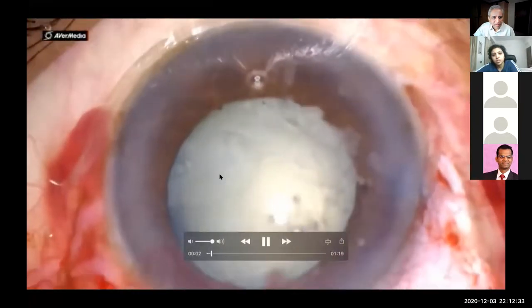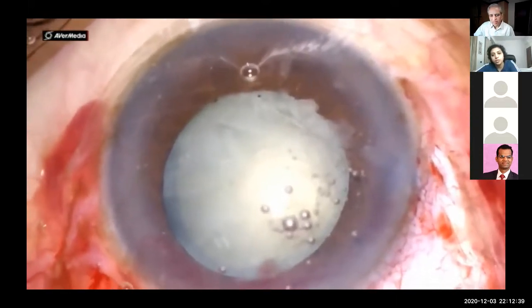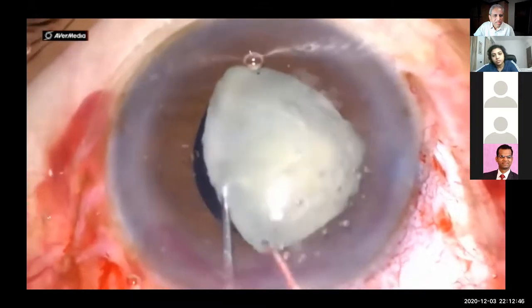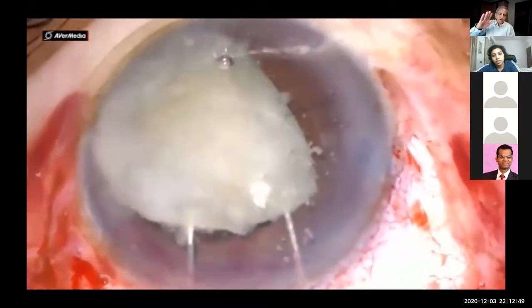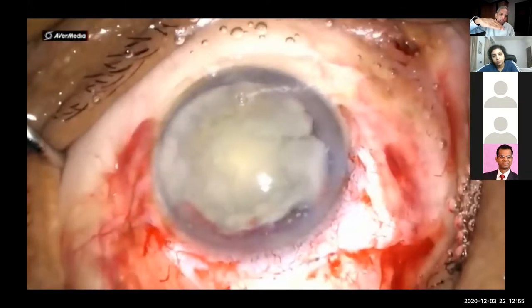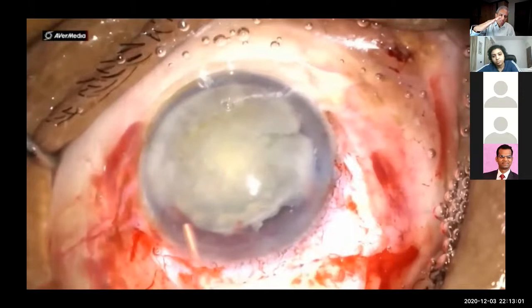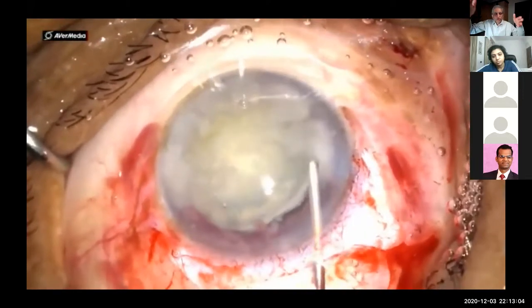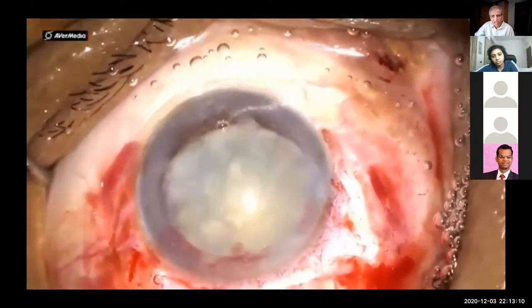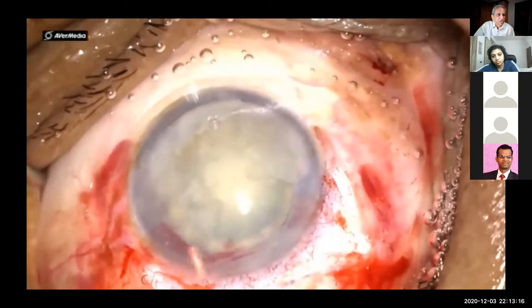Tell me again, doctor. The length of the scleral tunnel in this case was a little longer, probably. That was making it difficult to maneuver the vectis. Longer tunnels are not bad, especially depending upon the amount of astigmatism you have. But the whole tunnel is directed upwards, and then the whole tunnel goes down, and that distorts the cornea. If it's a long corneal tunnel, the entire tunnel has to be tilted down. That creates folds on the endothelium, and there will be some loss of endothelial cells if it's a very long tunnel extending onto the corneal side. So it has to be a balance between the length of the tunnel and how much astigmatism we want to get at the end of it.